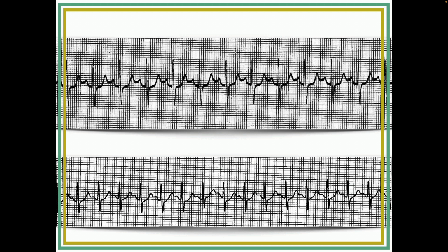So we talked about this last week, and it's possible we don't need this slide, but I tossed it in just to make sure everybody was on the same page on this. So Koa, what does the P wave represent? Atrial depolarization. Good. And Andrew, what about the T wave?